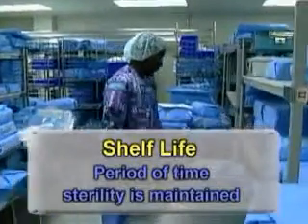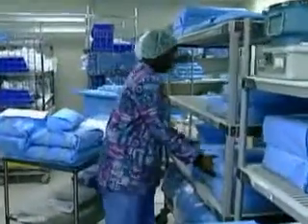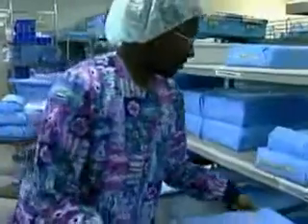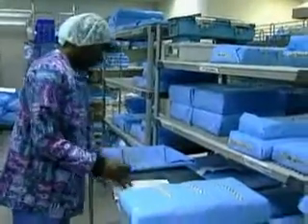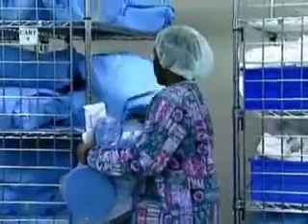Shelf life is defined as the period of time that sterility is generally maintained and is related to the capability of the packaging material and the storage conditions to protect the sterility of the packaged item. Shelf life should be considered event-related, not time-related. The number of times a package is handled can affect the package integrity.